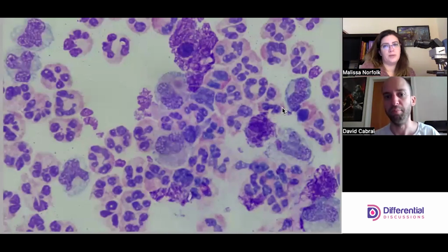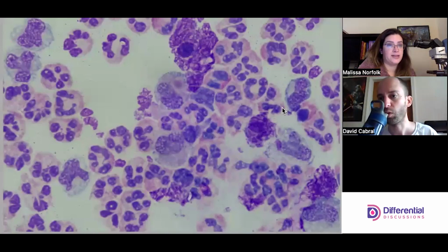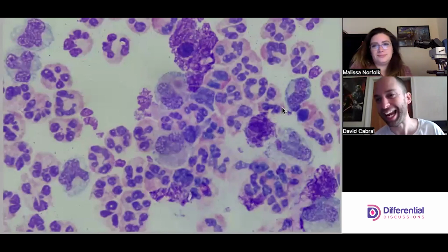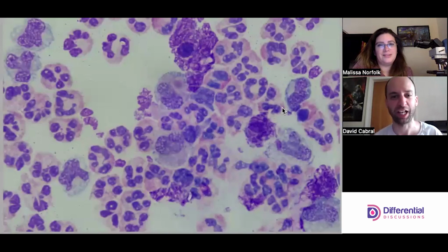And by that, we don't mean like it's a blast or a challenging cell to identify. We mean if you can't physically make out what it is. Don't skip it because it's hard. Skip it because it's physically not possible to figure out what it is. Excellent clarification there, because I hate when we skip things because it's hard. We should embrace the challenge and seek more experienced individuals.